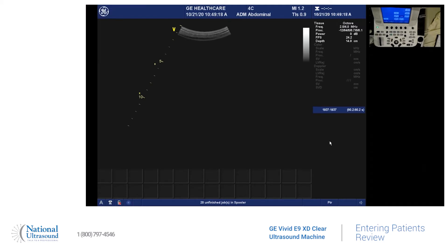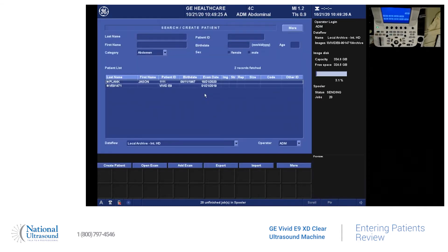So when you first log on, it's going to bring you to your main screen. A lot of the options are over here on this left side of the keyboard. So you're going to hit patient, and then you can go ahead and type in using your keyboard.